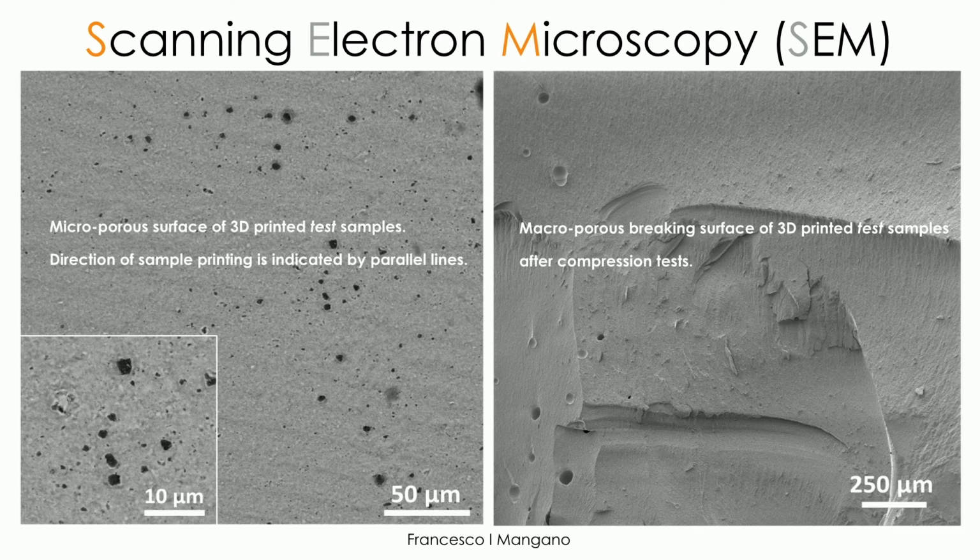So yes, finally the conclusion is probably it looks that the milled ones are more reliable, but we should not underestimate the positive things related to 3D printing. So everything is new, and we need to go deeper in order to understand better the properties of the 3D printed material that is totally different from the milled one.